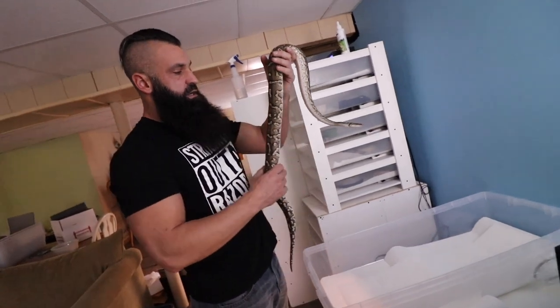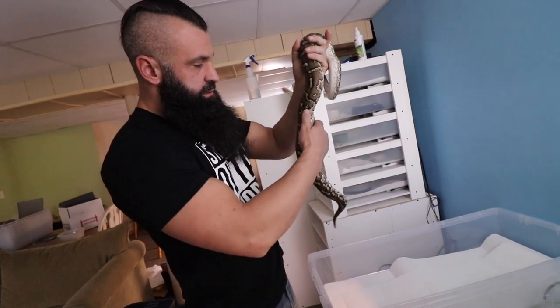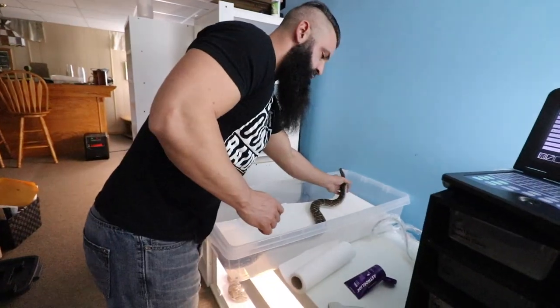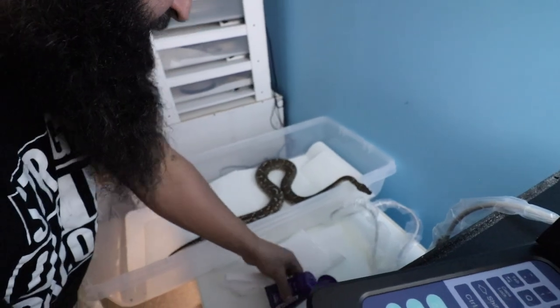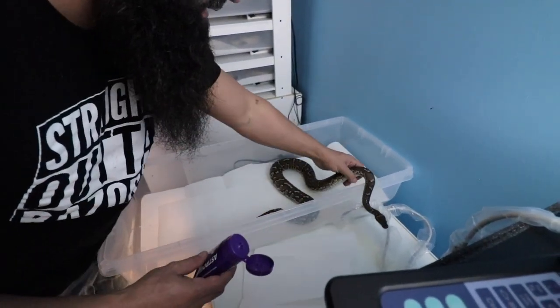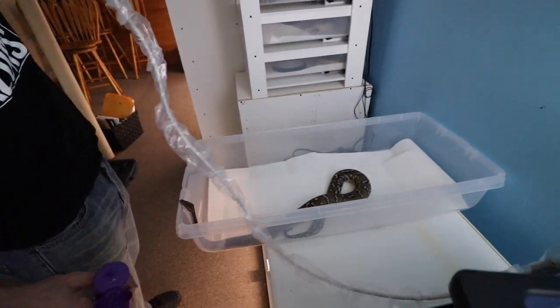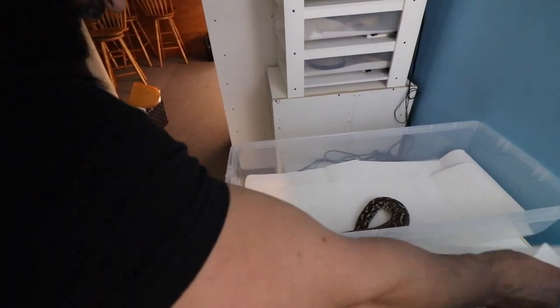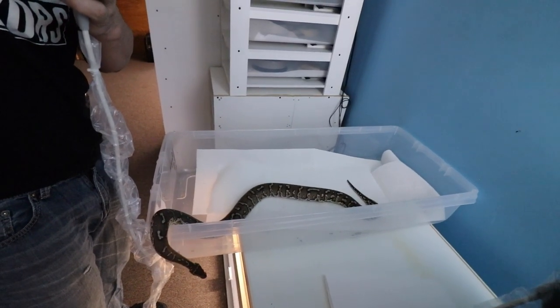All right, the next snake we're going to try is the Angolan python. The thing that has me nervous is that the scales are so beaded and bumpy — I just hope we can get a good enough image. Also, active snakes are kind of a pain; she won't just sit still like the ball pythons do. Ball pythons just sit there, which makes this easy. Angolans by nature are just very, very active. They are from Africa, and so are the ball pythons.